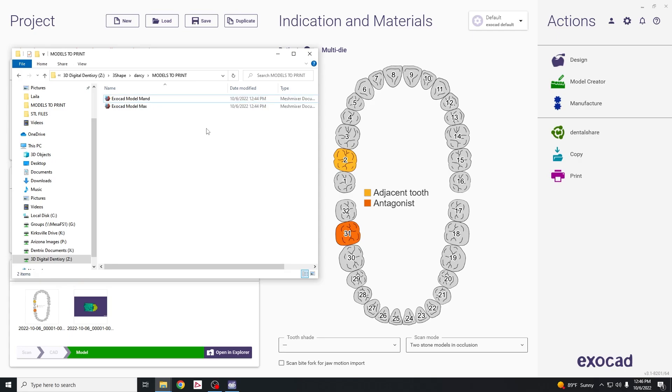This concludes our tutorial on how to turn an intraoral scan into a printable model.